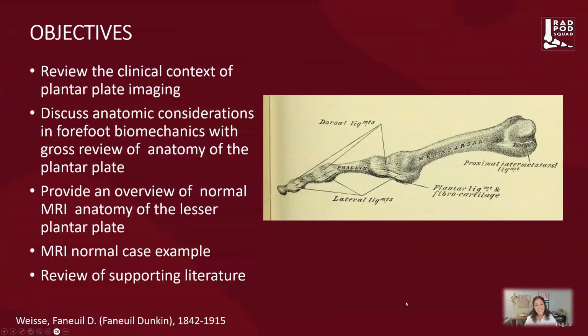Our objectives together will be to review the clinical context of plantar plate imaging. We're going to discuss anatomic considerations in forefoot biomechanics, with a gross review of anatomy of the plantar plate. I'll provide you with an overview of normal MRI anatomy of our plantar plate and a normal MRI video case example, and we'll follow that with a review of plantar plate literature.